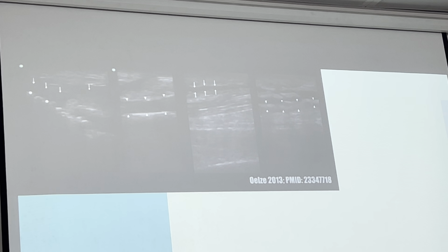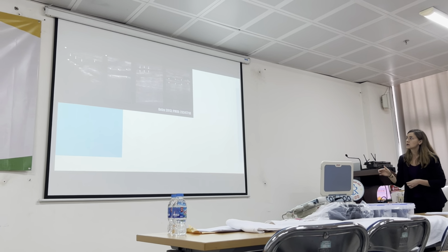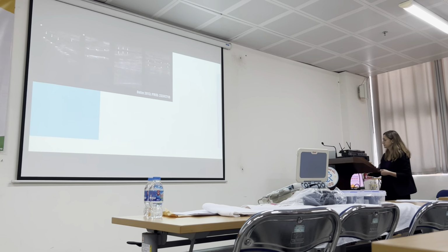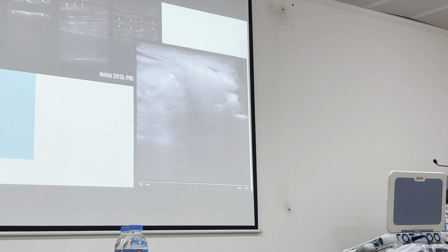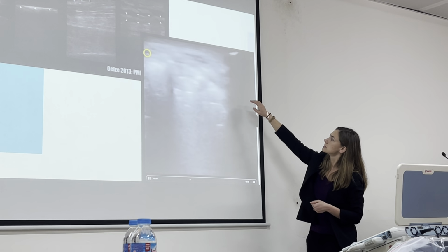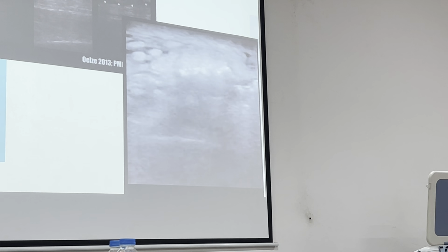I will say, always put on color flow in case you're accidentally seeing the vessel in the long axis, and also check in the short axis, again, to make sure that you're not mistakenly seeing a vessel. Versus here, this one's a little bit more easy to see. You see the diffuse gas. So we have here and here with those bright white lights.